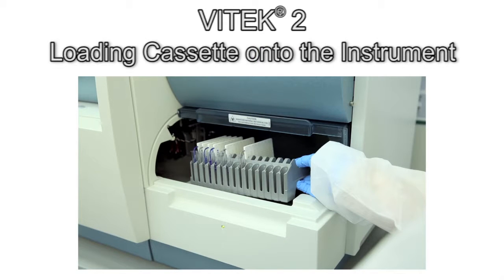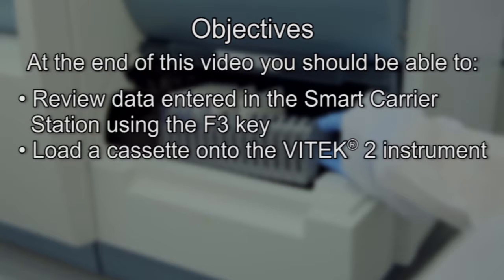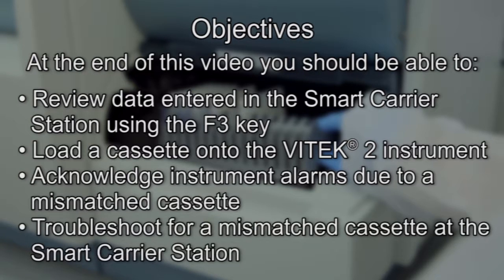This video demonstrates reviewing data entered in the Smart Carrier Station using the F3 key, loading a cassette that's ready to be tested onto the Vitek2 instrument, and acknowledging instrument alarms due to a mismatched cassette and troubleshooting discrepancies for a mismatched cassette at the Smart Carrier Station.